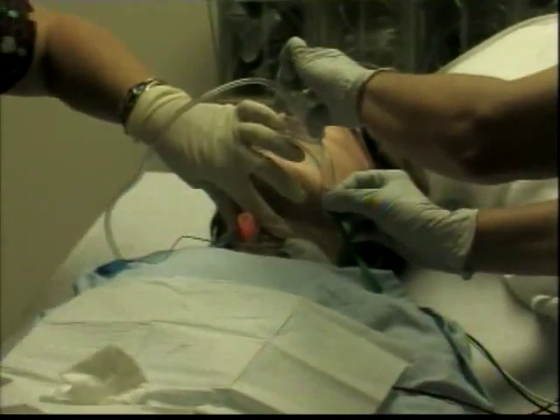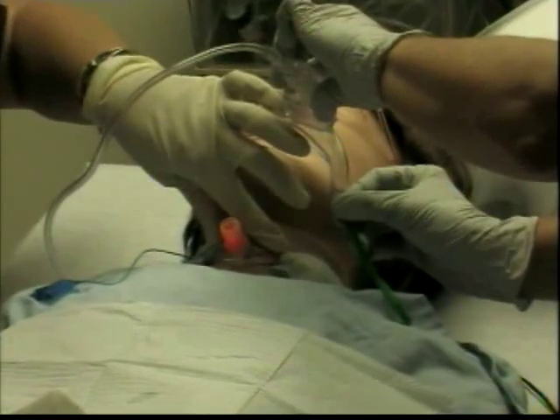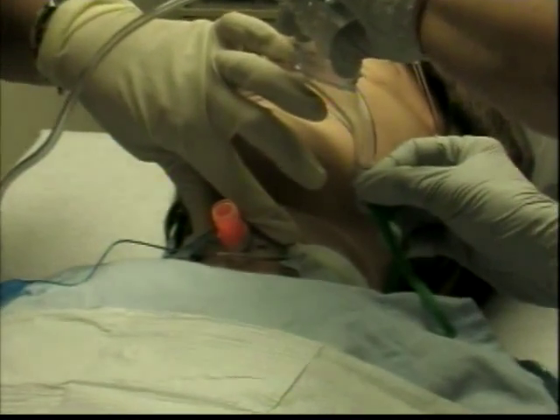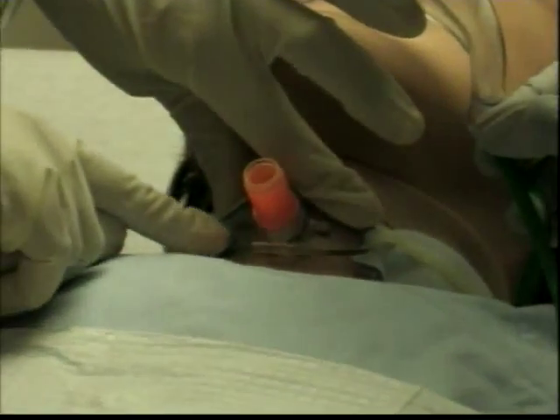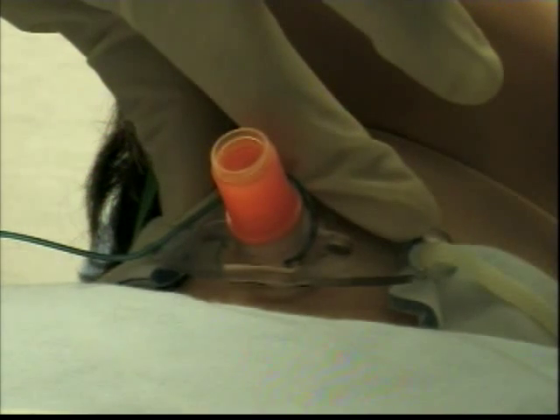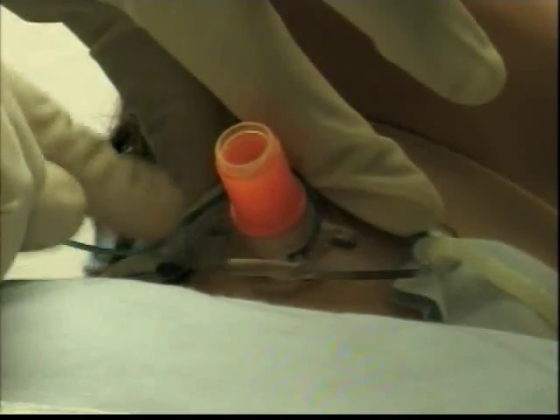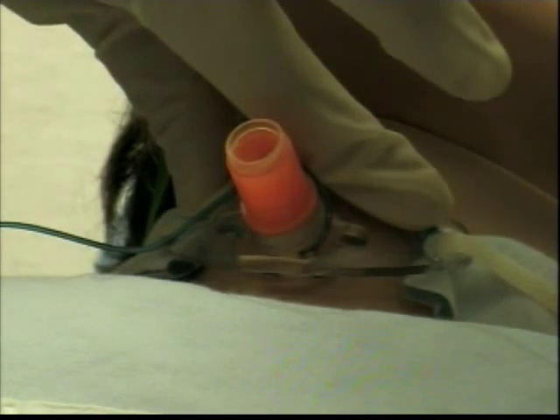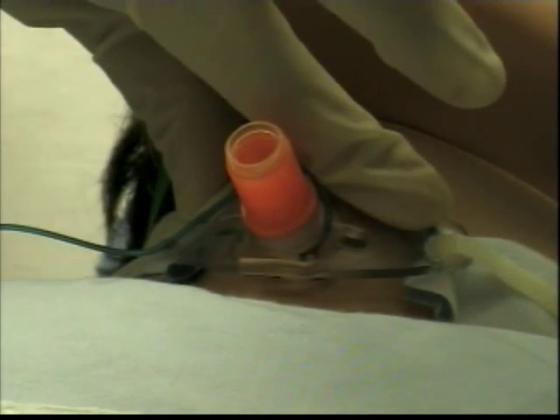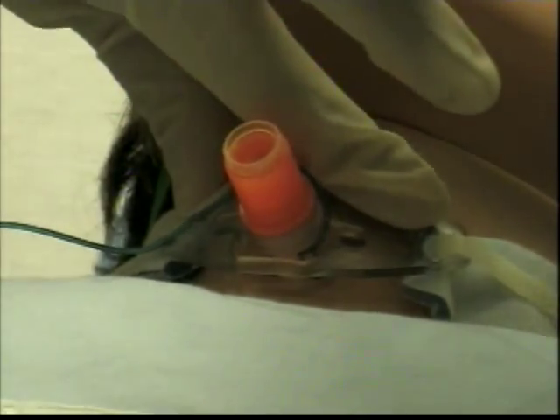Okay? So at this point, the trach is clean. At the same time, you want to make sure that you assess the stoma. If you see any blood or any little sores or anything like that, make a note of that so you can tell the physician when you are giving them report. You want to make sure that it's nice and clean, it's not red, it's not oozing, doesn't have any pus. And then we're now going to change the tube holder.